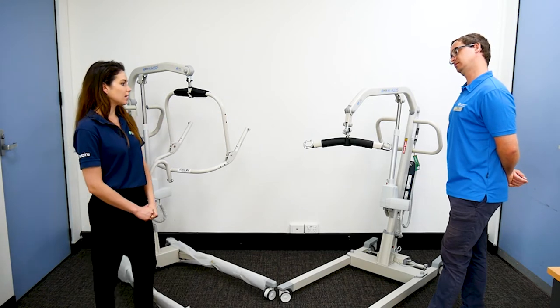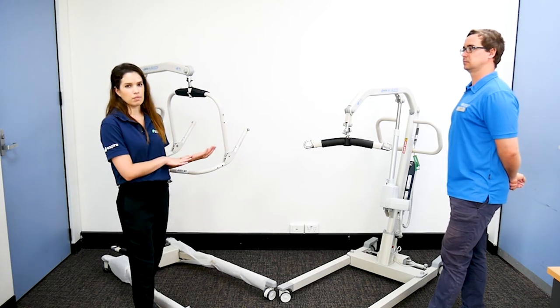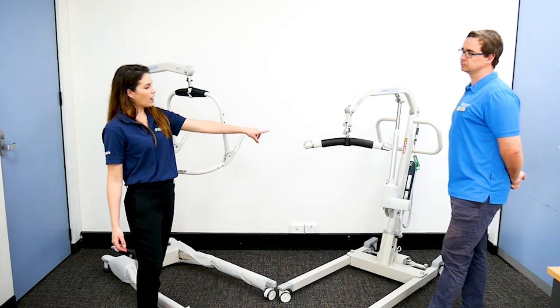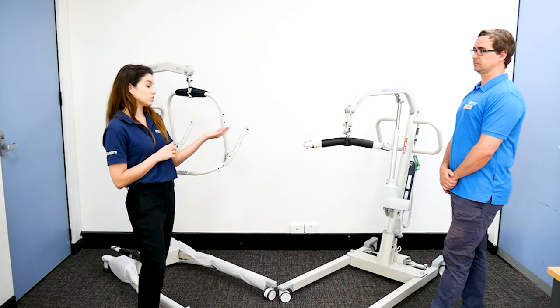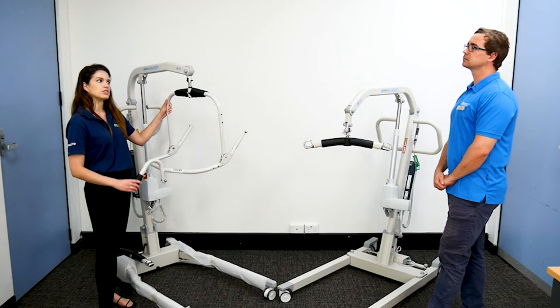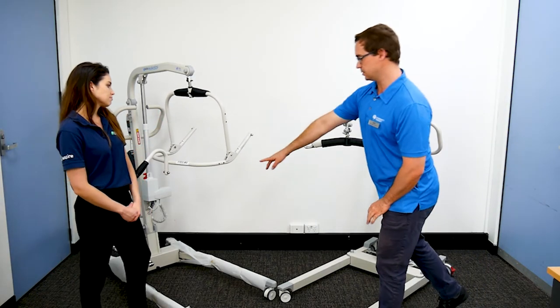When thinking about loop slings and a spreader bar, if I am planning a transfer in my head I would be thinking about what piece of equipment we're transferring from and what we're transferring to, and I would manipulate the different loop straps on my sling to change the person's position that way. So there's a bit more planning involved, whereas with this style you can change their position while they're in the sling.